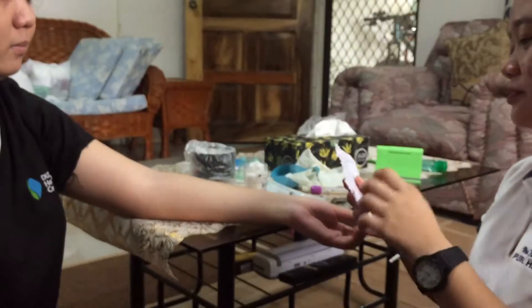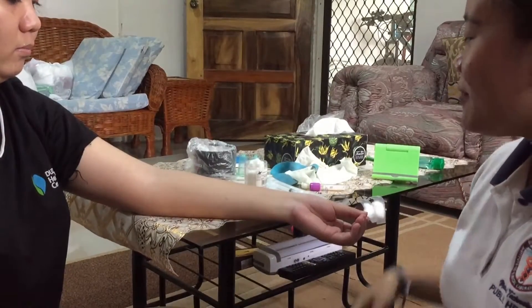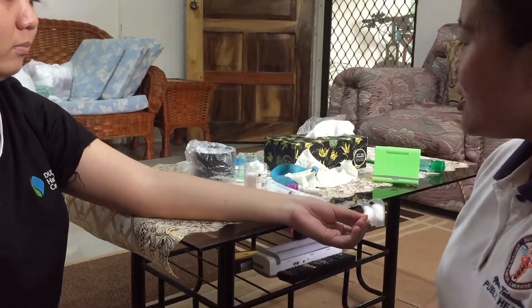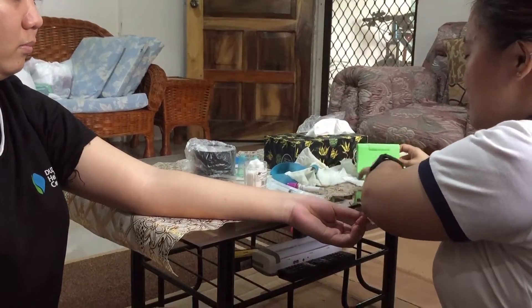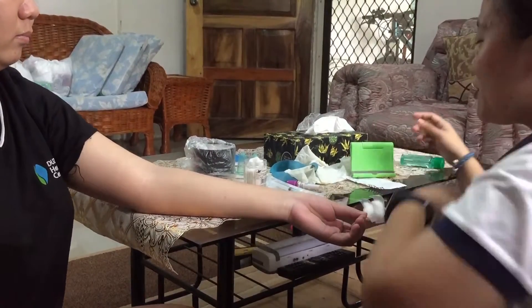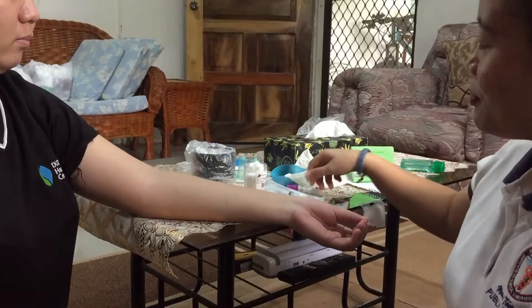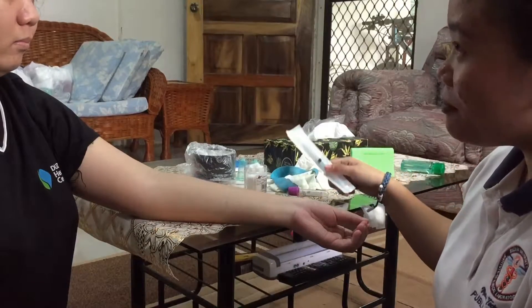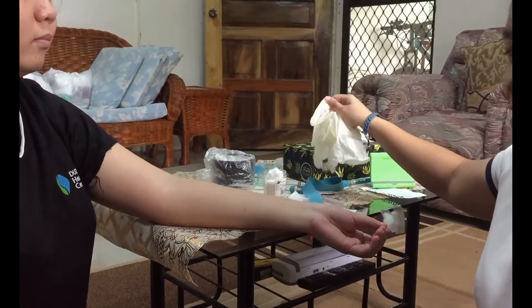Hello, ma'am. I'm Farida Mae B. Wong, your medical technologist for today. For today, you have a request for CBC, so I'll be performing venipuncture on your arm. Put on your gloves.